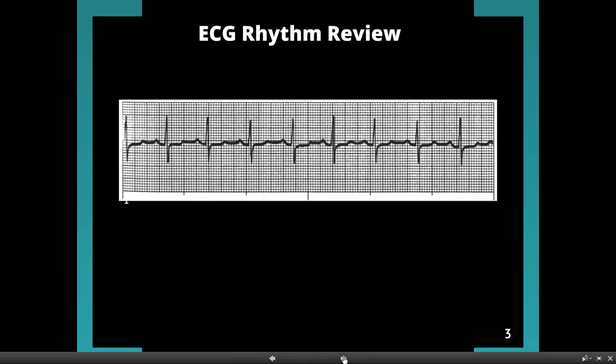Here we are at our first attempt at EKG recognition. Hopefully you are looking at the strip. You can see some familiar components, maybe a couple of QRSs, some P-waves, that sort of thing. Let's use our system and see what kind of rhythm we have here.